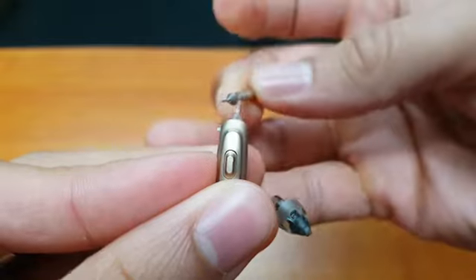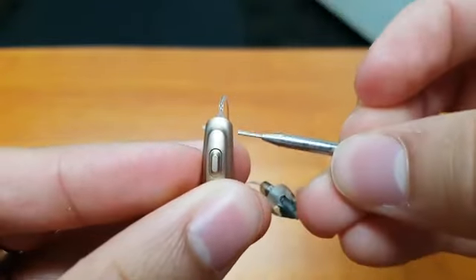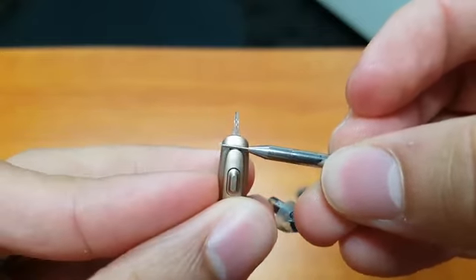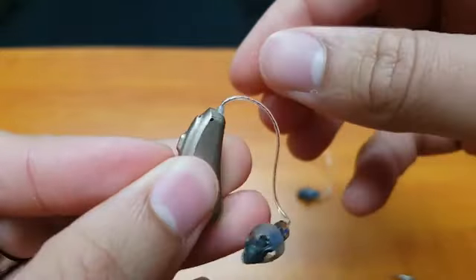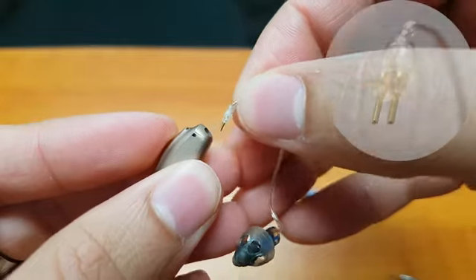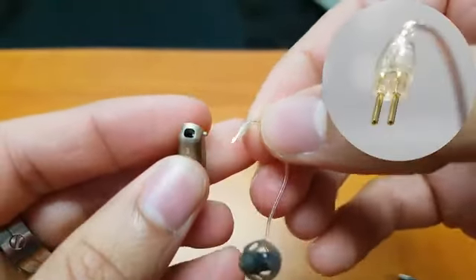you will notice that that pin comes out on the other side. Now that pin will not go all the way through, so you can push quite hard and it just stops from going all the way through. Now if we come around to this side and pull the receiver out, you can see two pins there.